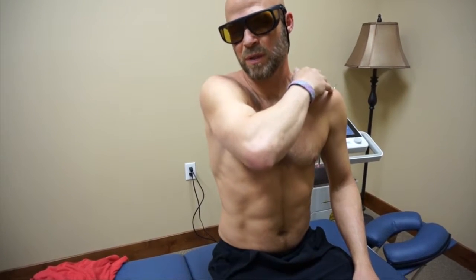Before it was maybe just over the top of the shoulder, but now that's inches of improvement. Right now it's grabbing maybe a little bit, but that's significantly further than where we started.